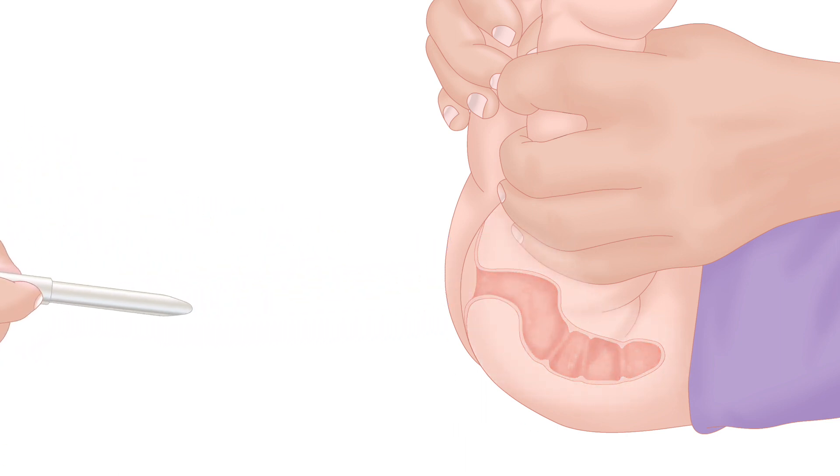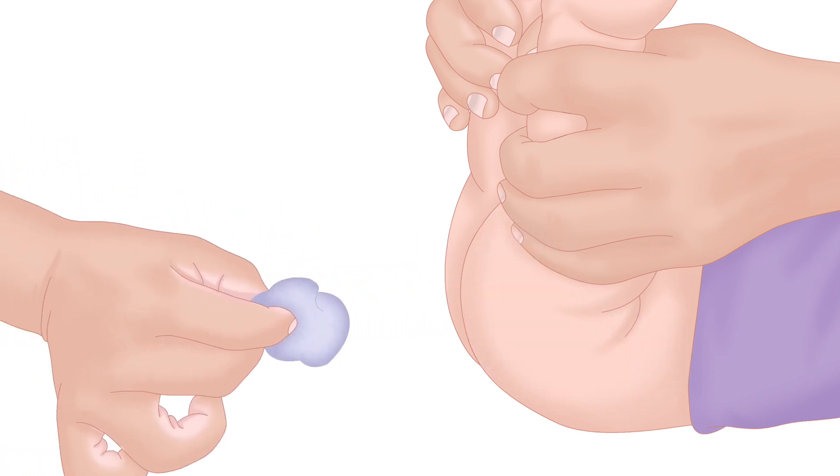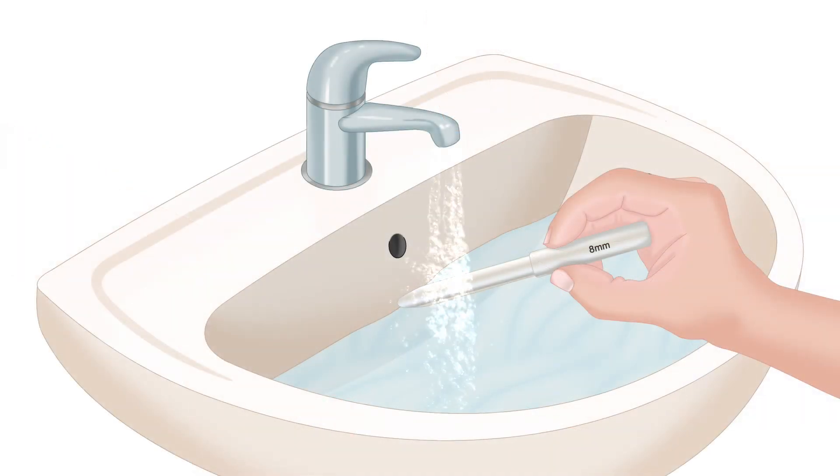Gently remove the dilator, change your child's diaper, and wash the dilator with warm soap and water.